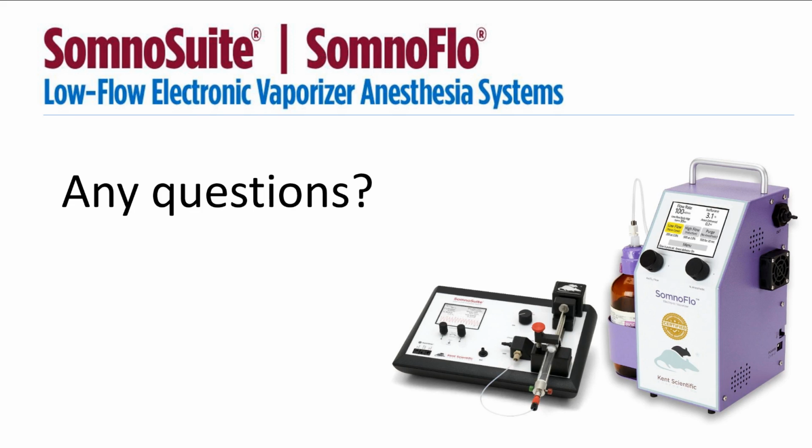And next polling question here is, which anesthetic do you usually use? Isoflurane, sevoflurane, or injectable?